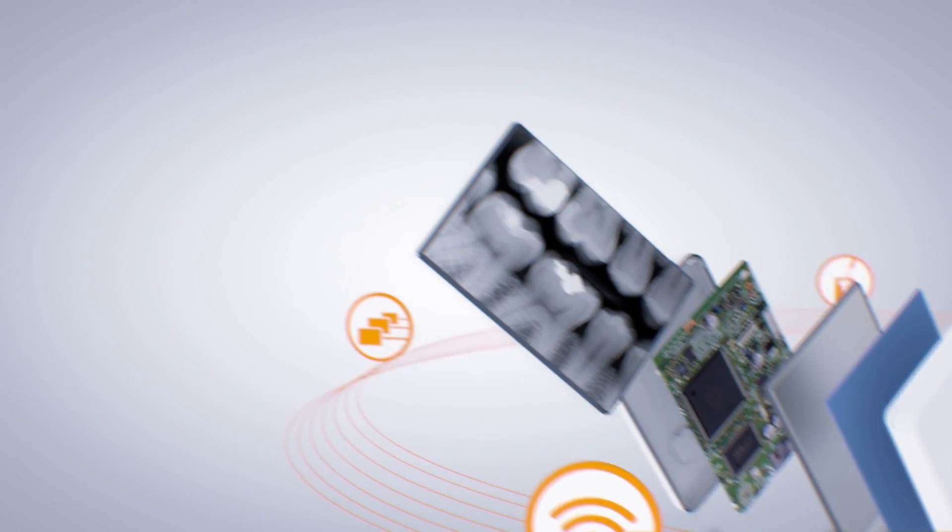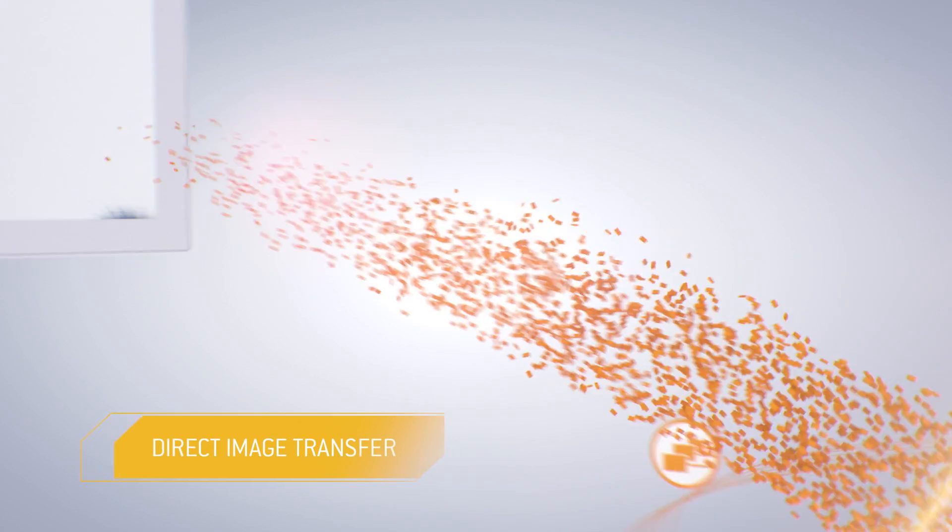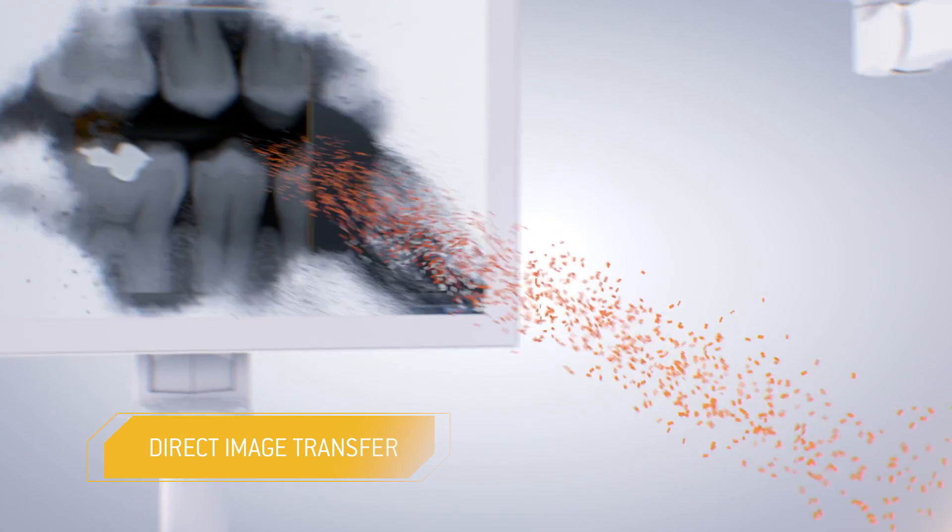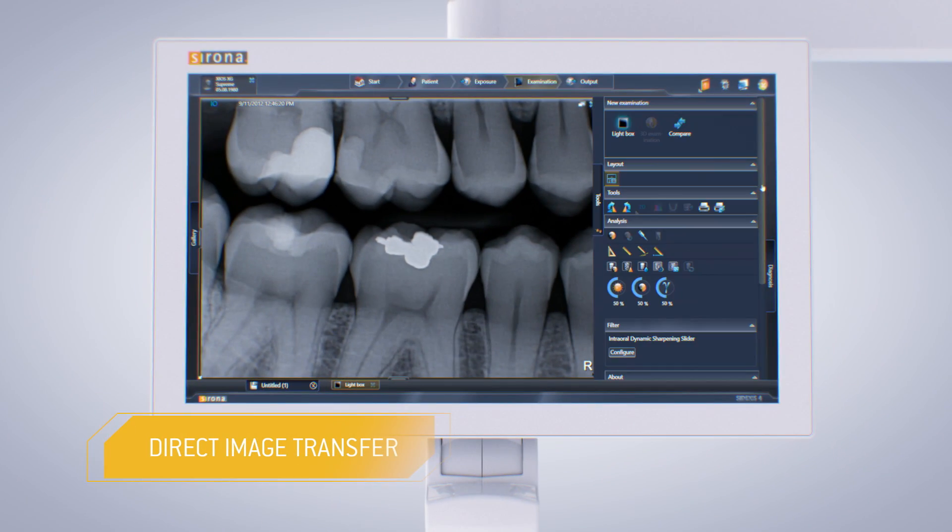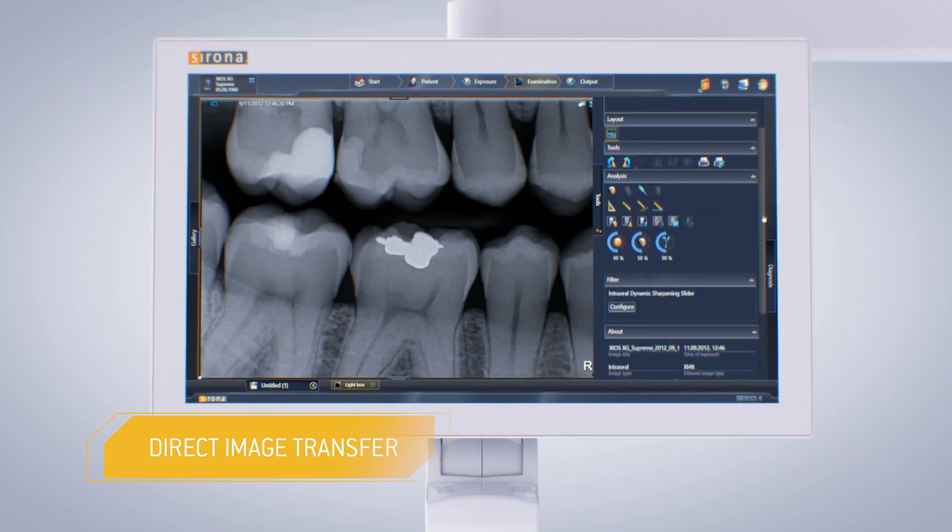The intraoral images are transferred directly to the Sodexis 4 imaging software, where they are ready for your diagnosis.